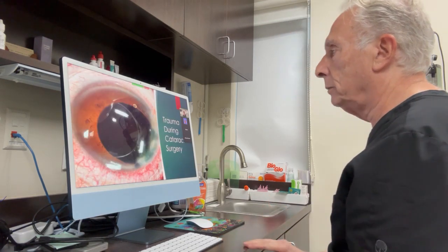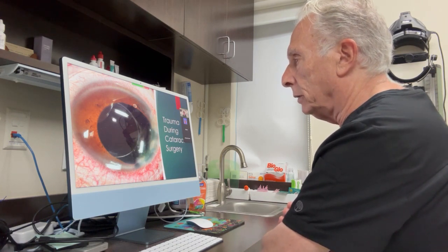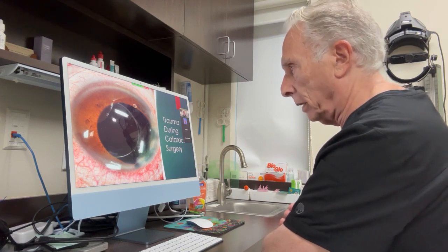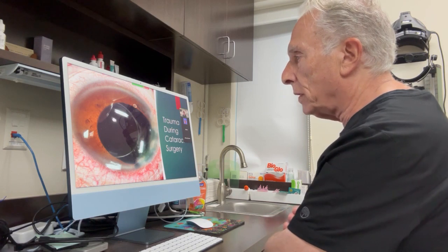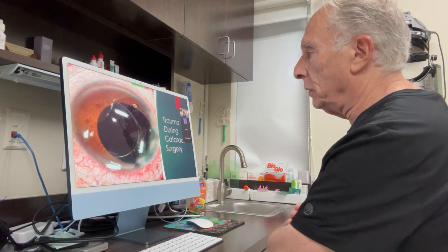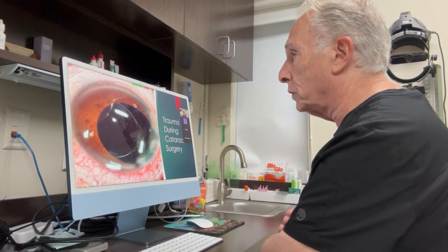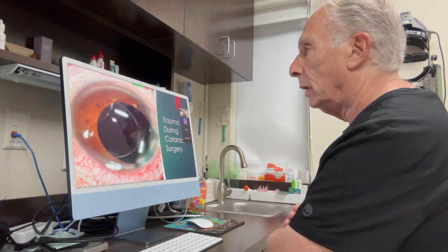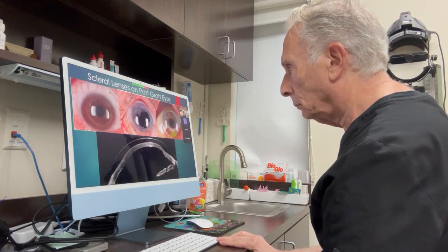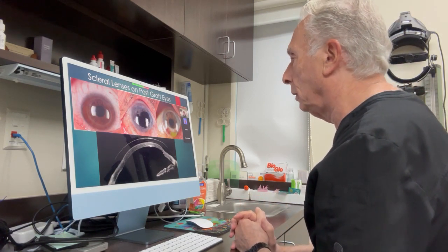Here is another eye. This patient was taking medication for restless leg syndrome, and during cataract surgery, the patient's body and leg shook violently. It took several technicians to hold him down, all of this while the cataract surgeon was inside the eye. So you can see part of the iris is ripped away, and you can see the IOL there. In any case, the patient's doing really well with a scleral lens. You can see the outline of the scleral lens in the top left, and the top right also. These are three different eyes that we worked on with a scleral lens.